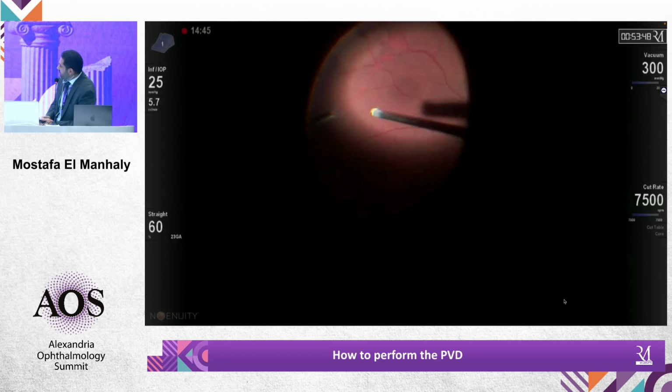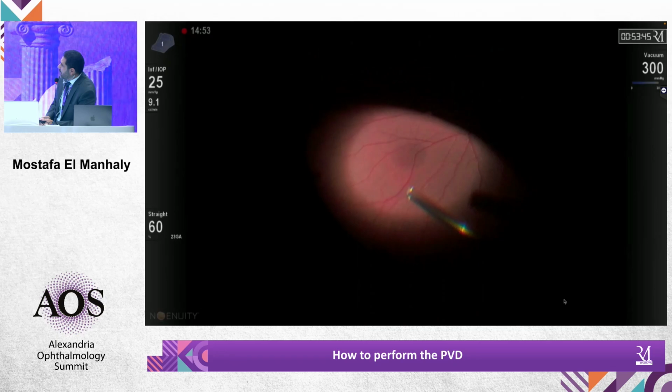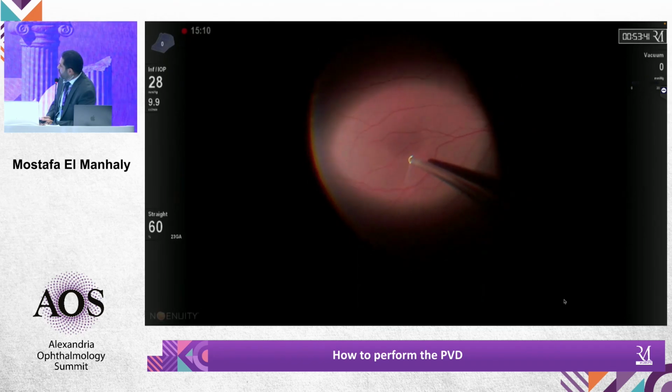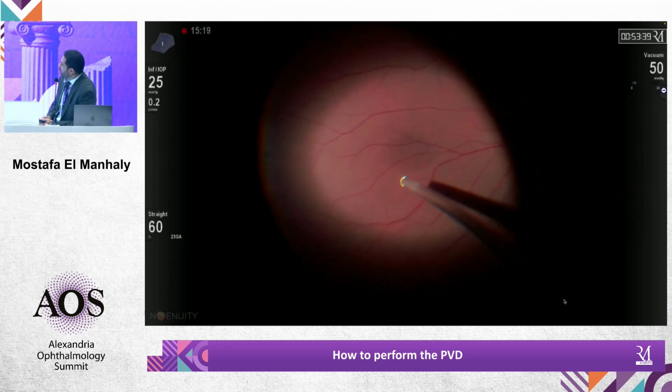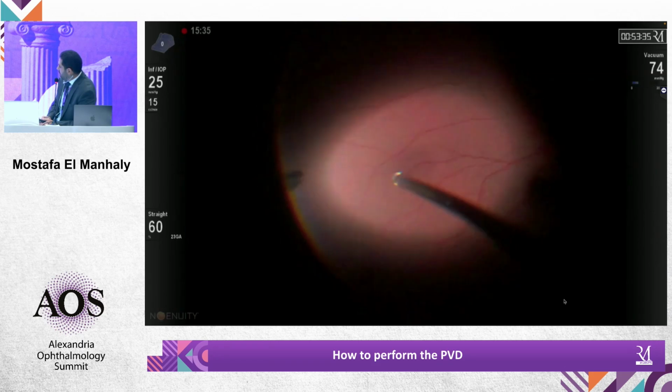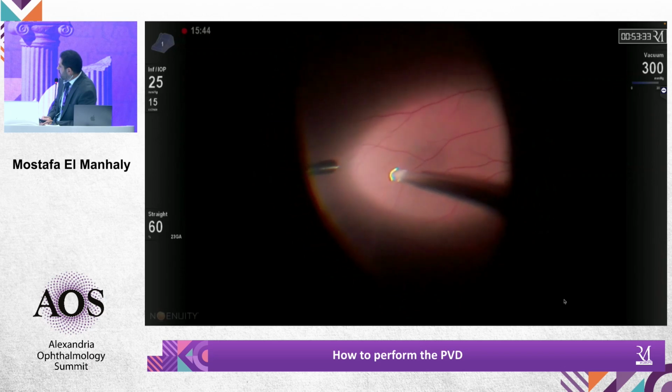Okay, so Dr. Moghazi, at this step, do you feel that we have done the job and we start to peel the ILM, or do you ensure some vitreous cortical remnant at the periphery? For sure, there are some vitreous cortical remnants at the periphery, but let me add to the first question.